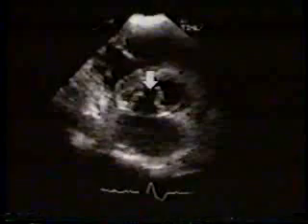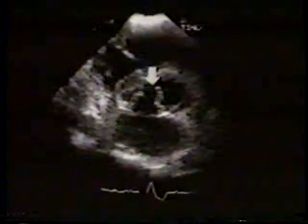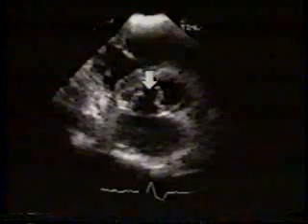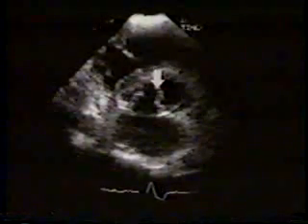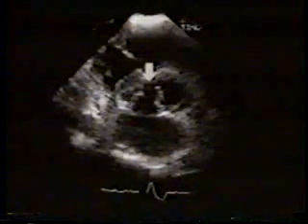Here we are demonstrating the cleft in the anterior mitral leaflet. The cleft divides this leaflet into two nearly equal halves, the medial component and the lateral component. This can be well appreciated in real time.